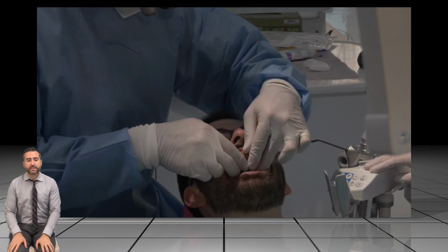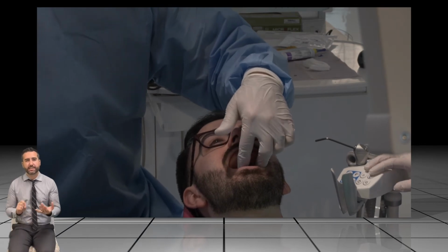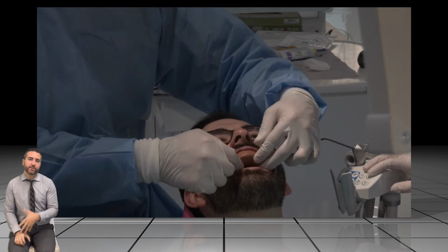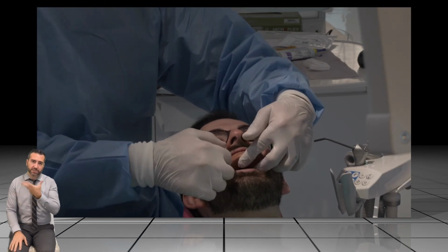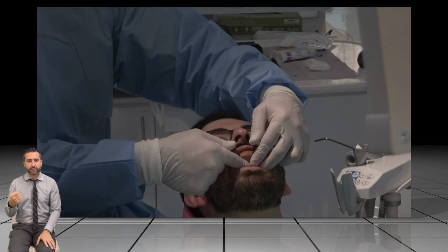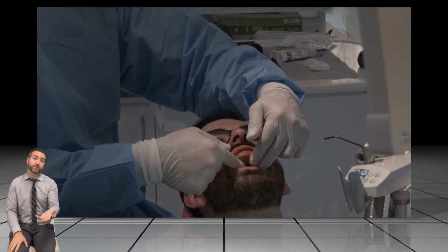And within about 60 seconds, this is going to be pulled out of the patient's mouth, and what's going to remain, because of the accuracy of the intraoral scan and the accuracy of the 3D printer, the only thing that really remains is what was added digitally. So you don't have a lot of flash all over the gingiva and palate area. It's basically non-existent. You could flick it away with an explorer, and what's left is just the perfect, beautiful wax up that you did digitally, which the patient was a part of.